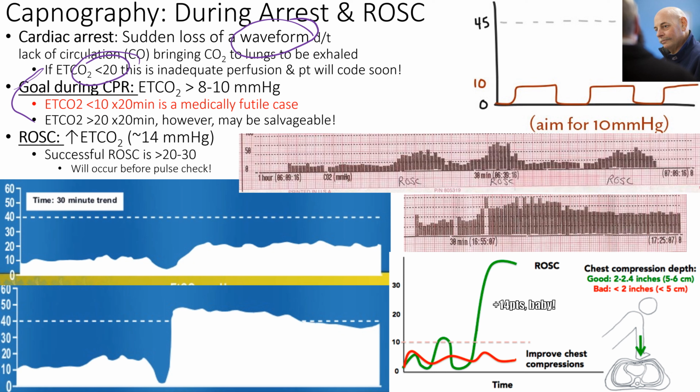They're getting weak, and end-tidal CO2 is great because it gives us valid numbers from all the cardiac arrests that happen. We can see the end-tidal CO2 is less than 10, which is expected with CPR, and it's been 20 minutes. You can say with 99% certainty that it's futile. There's a very, very small chance they do get a pulse back, and if they do with an end-tidal less than 10 for more than 20 minutes, the outcomes even then are horrible. They're not going to be leaving the hospital. You do see 42-minute arrests, but with an end-tidal CO2 less than 10, that is not usually a sustainable thing; it's futile effort.